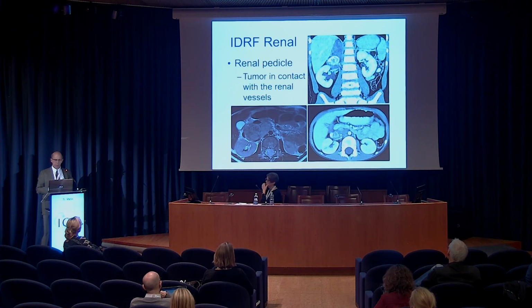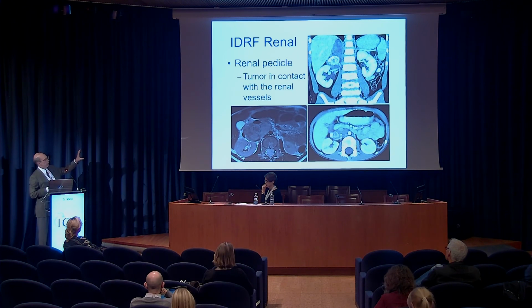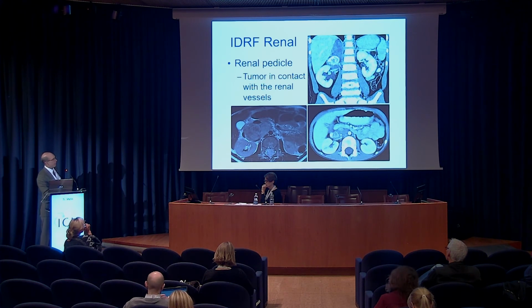And finally, with respect to the renal pedicle, because it presents a particularly important surgical risk, meaning saving the kidney, the renal pedicle is handled separately. In contrast to the aorta and the IVC, where you can partially envelop or partially encase the aorta, any contact of tumor with the renal vessels is considered an image-defined risk factor. So that's an important thing as well.